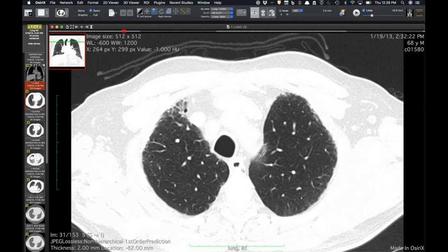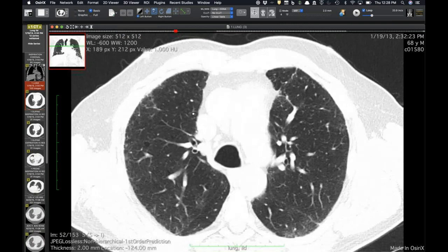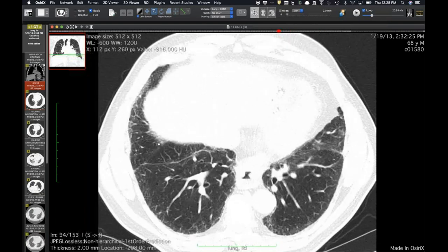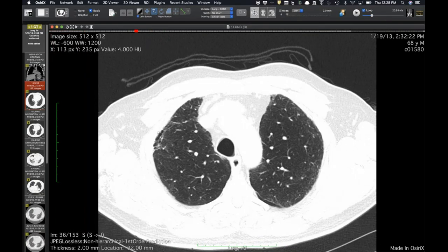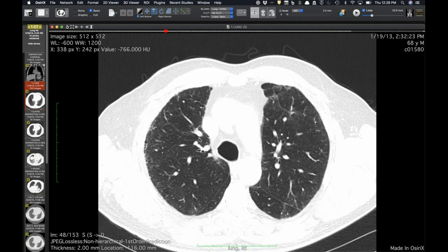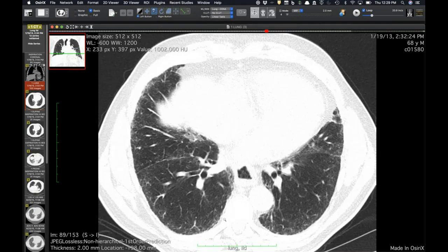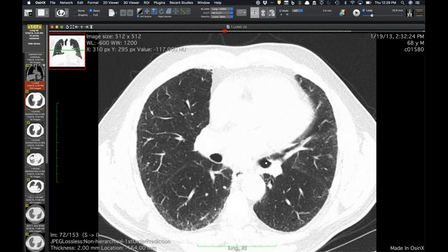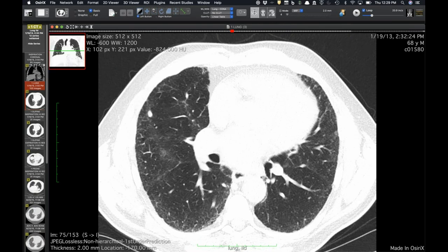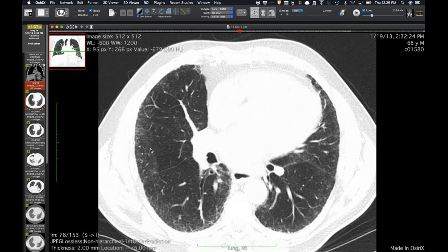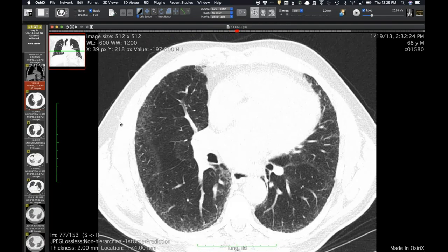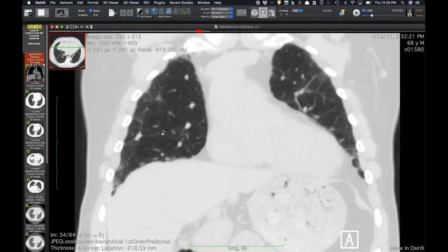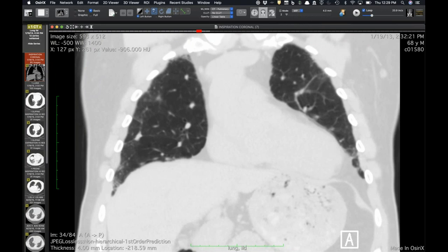This is a patient from our ILD clinic from a couple of years ago - evaluation for fibrosis. With the new Fleischner and ATS guidelines, we have definite UIP if you see honeycombing. You can argue whether there's honeycombing here. Back when this was done in 2013 with the biopsy, it was considered a possible UIP pattern, which now would be classified as probable UIP because there's enough traction bronchiectasis. He's an older man, and surgery confirmed UIP - he's been diagnosed with IPF. The biopsy was done outside; they were worried about cancer, knowing patients with UIP have a higher incidence. But we see a ton of patients with UIP who also have intrapulmonary lymph nodes, seen more in patients with inflammatory processes or smokers.